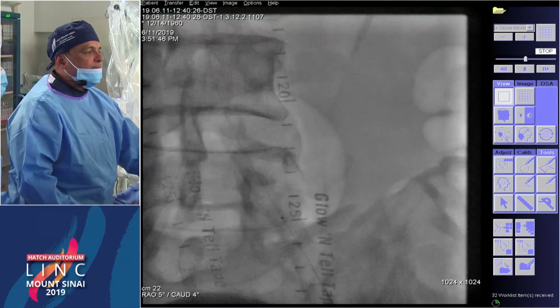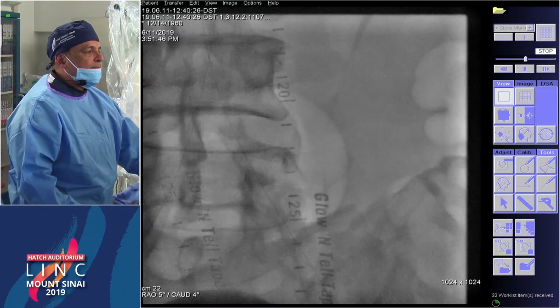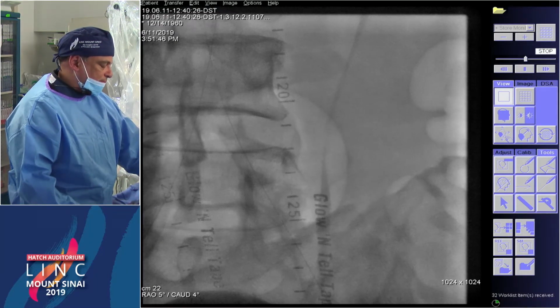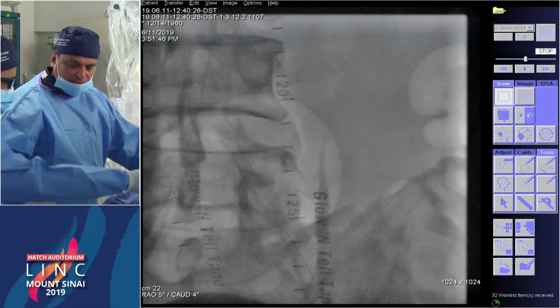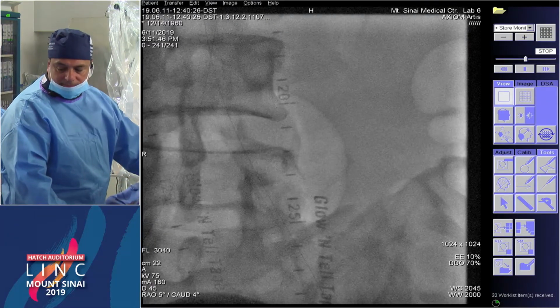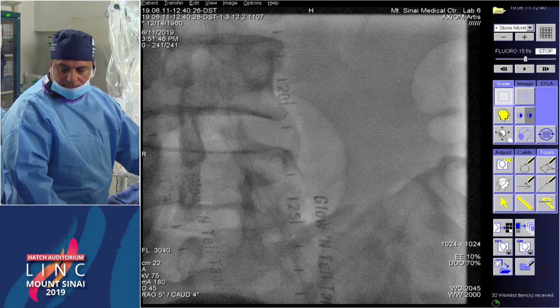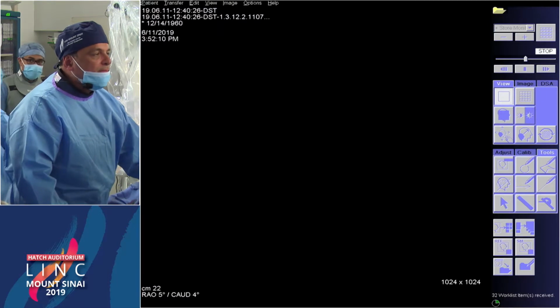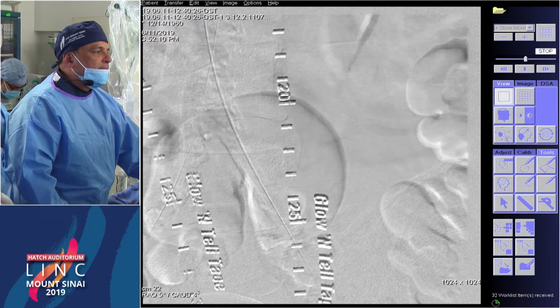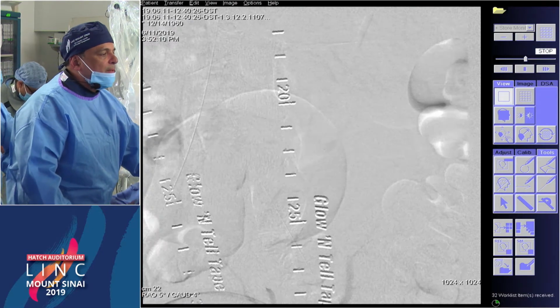PK, you may be able to educate me on that one then, because I generally use the covered stents to try and inhibit further intimal hyperplasia in reaction to the angioplasty. So I'm not sure if I would change my algorithm by using Shockwave. I'm not worried about embolization because the Shockwave really affects more the medial calcification. So what would be your reason not to use a covered stent with using Shockwave?